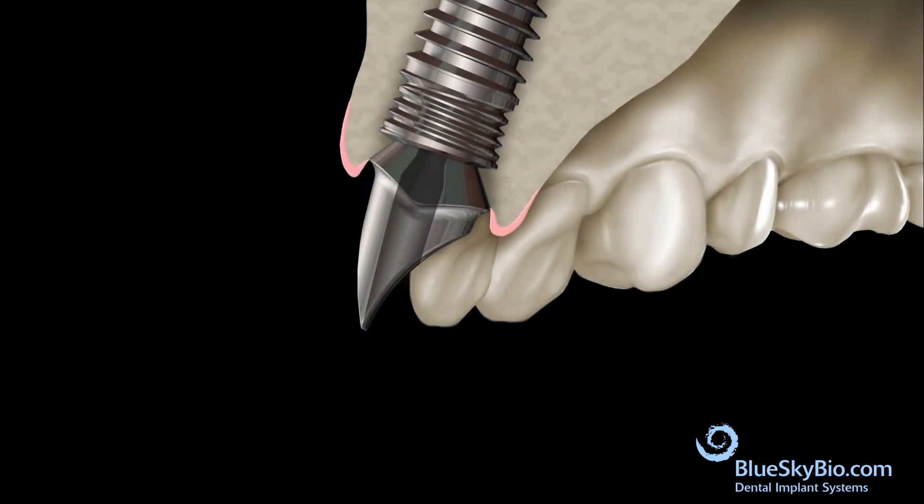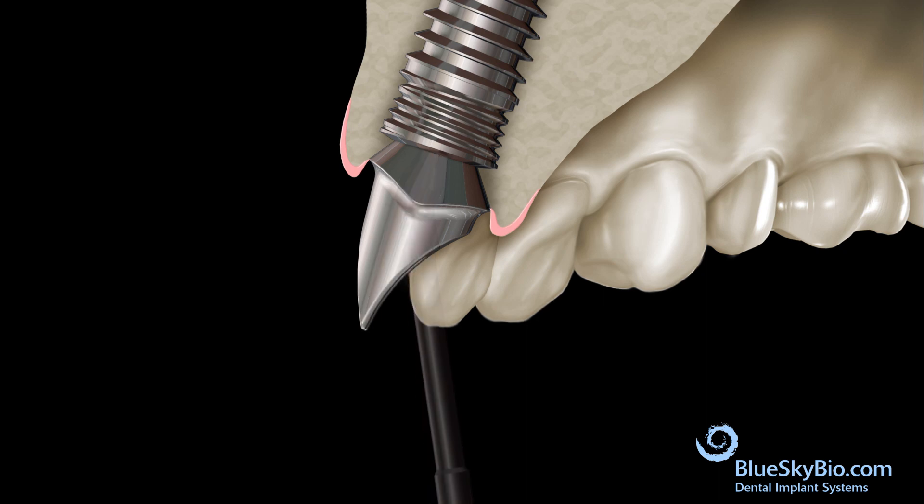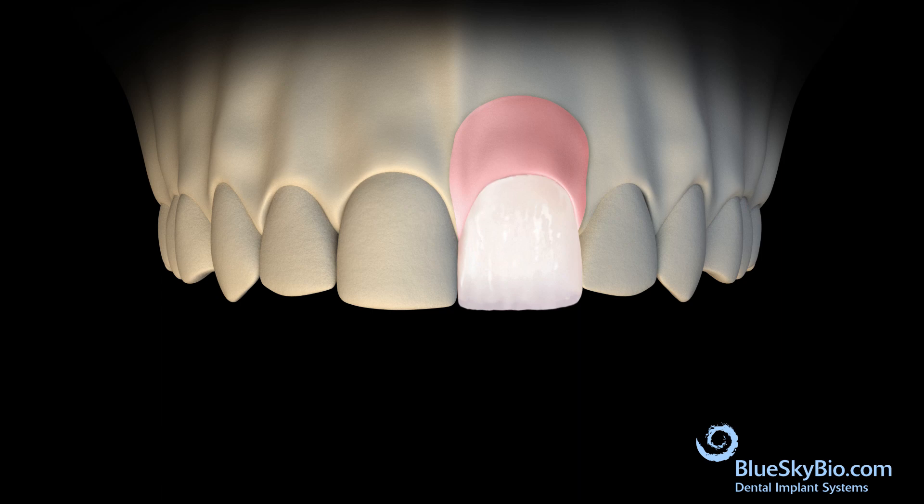Insert the fixation screw with an angled screwdriver. A slot is made to give the angled driver access. The screw should be torqued to 30 newton centimeters. Place the crown into the stone model to verify fit.